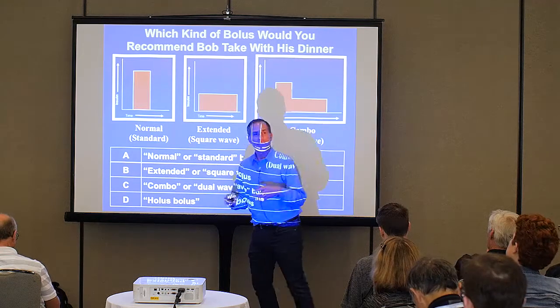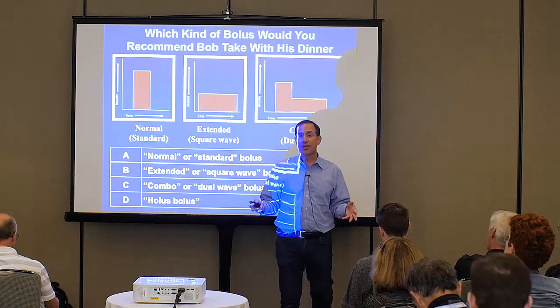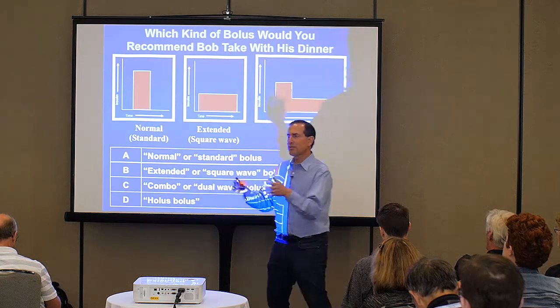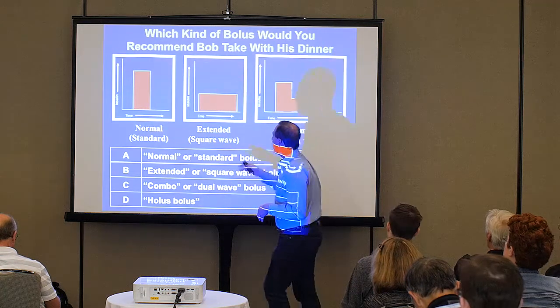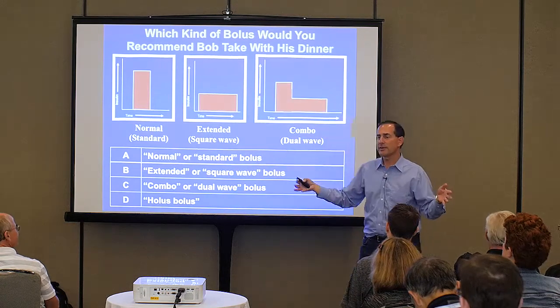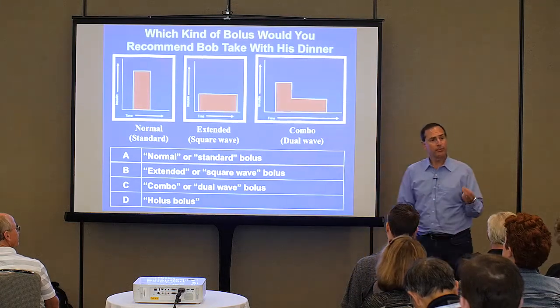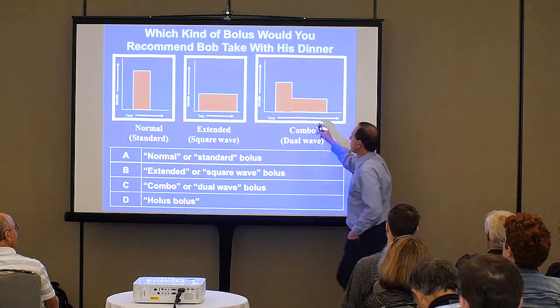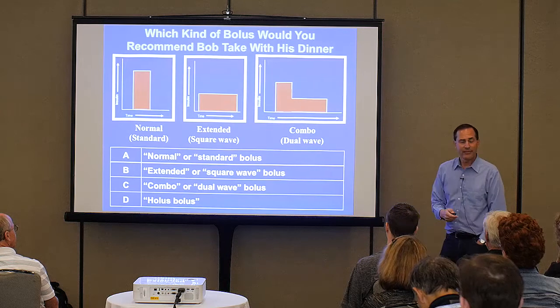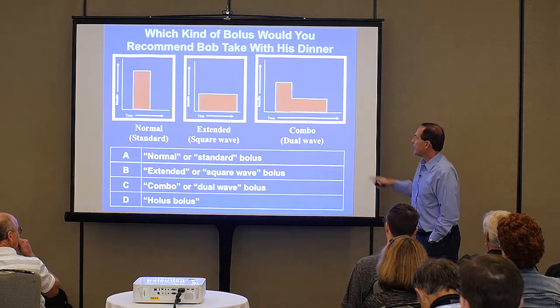If, however, it's like Thanksgiving dinner, you're sitting down, it's going to be like a three-hour meal, but fairly evenly spaced out and proportioned, then you want to give your bolus over a longer period of time to cover the longer duration of your meal. But if your meal is made up of certain foods that are absorbed quicker and certain that are absorbed longer, like this guy, then that's a good choice.